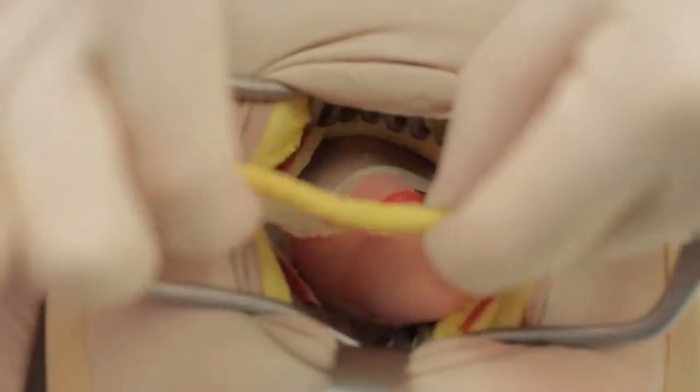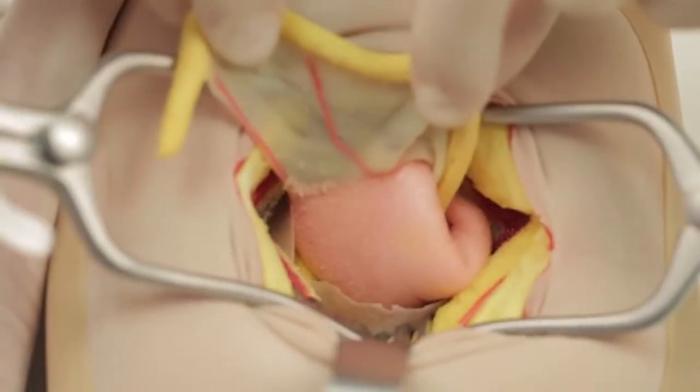View the mesoappendix against the light to identify the appendicular artery, which enters from the medial aspect.